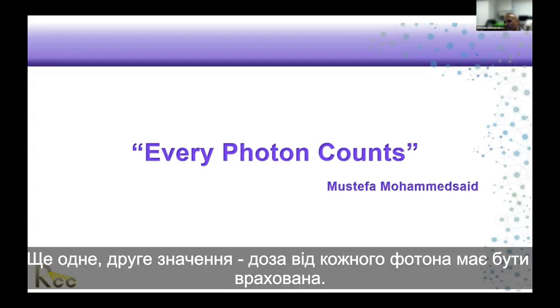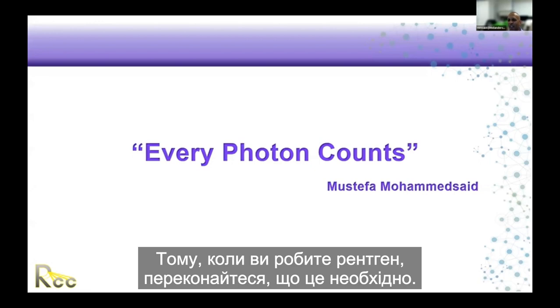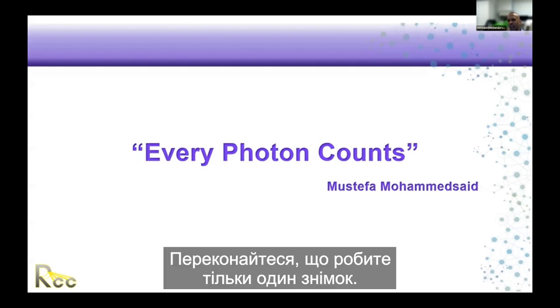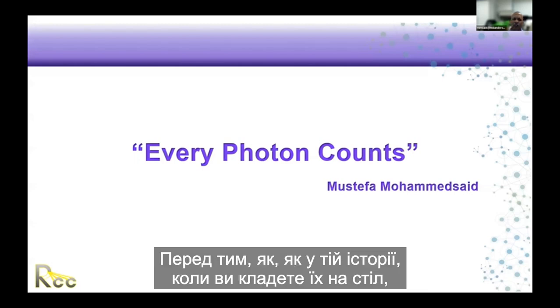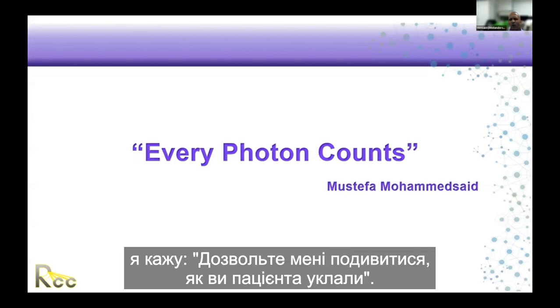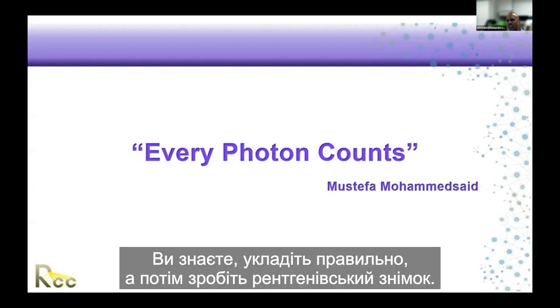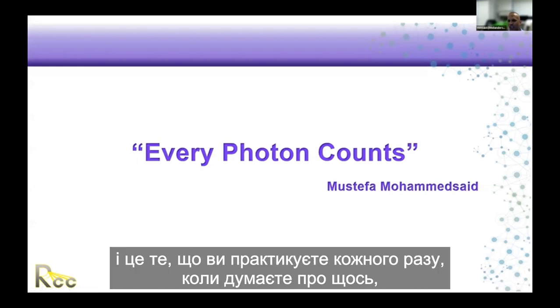The second meaning is make it count. When you take an X-ray, first make sure it's necessary. Second, make sure that it counts, so that you only need to take one X-ray for that. Positioning first. Instead of putting them on the table and saying, let me see how the setup is, get them positioned first. Put them on the right spot, then take the X-ray. Make sure every photon counts. Practice ALARA every time.